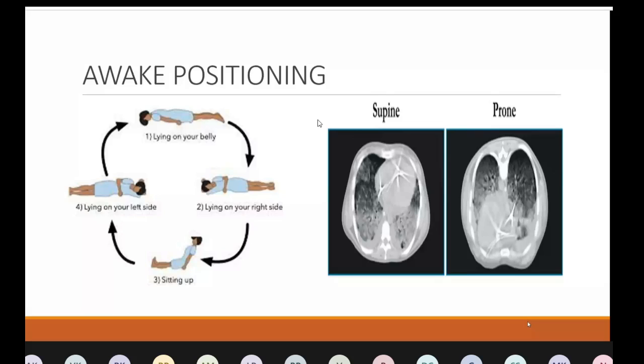And this was a slide from NEJM, and we can see that the transpulmonary pressure is highest in non-invasive ventilation. Even in mechanical ventilation, for example in a patient who is well sedated on the ventilator, the alveolar pressure generated is 9.